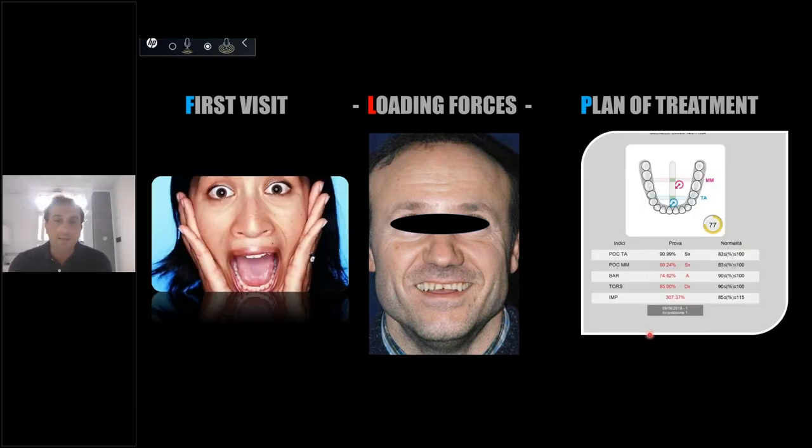I did the exam, and I looked at the screen, and I saw, oh my God, the impact was 307. So three times more than normality. And I thought, I made a mistake. I have a problem. I had a problem during the exam.